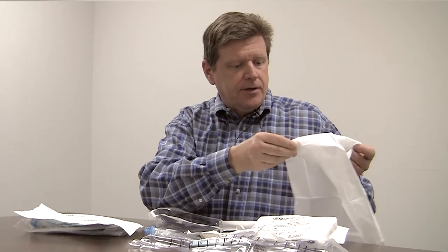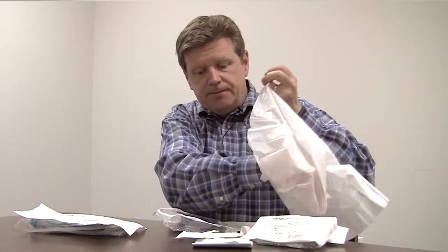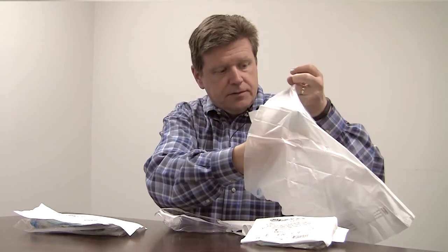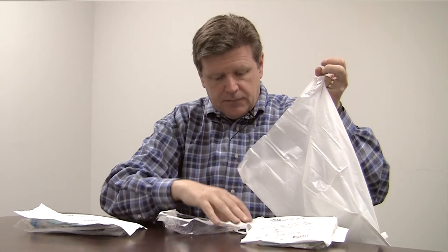One big advantage that we include with the Mini-Pak products is the privacy bag. This is a discreet disposal method to discard the used catheter and supplies when you're finished. It has a little handle on it — just open the bag — and you can put the used catheter and all the supplies right in this privacy bag and discreetly dispose of the contents when you're finished.